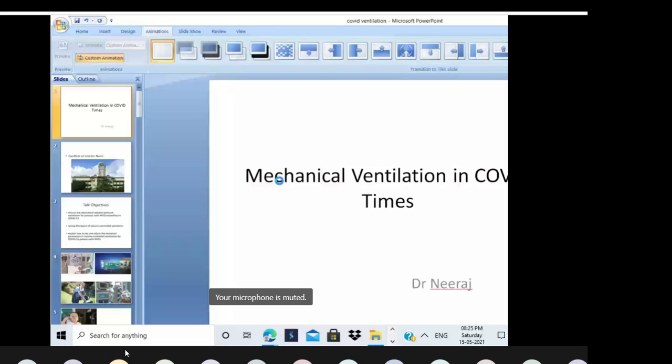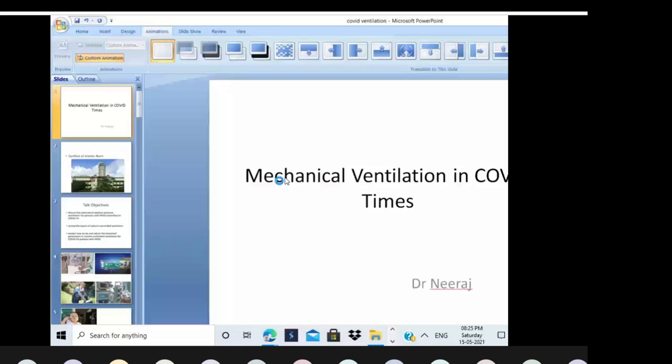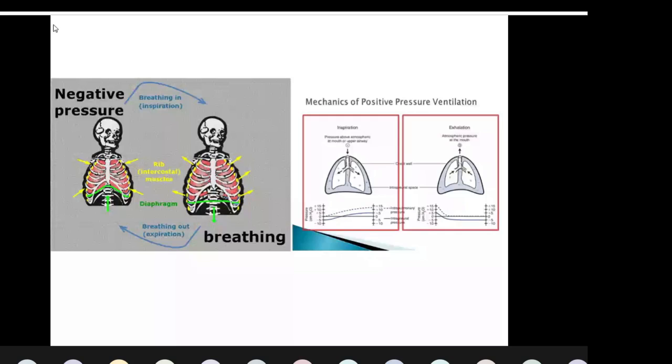It's the normal physiology. This is in a normal respiration. This is what happens as well in a non-invasive ventilation. But when it comes to invasive, this is taken topsy-turvy. What happens in invasive ventilation is that your machine creates a positive pressure and blows that into your nose or airway and into your lung. And you are made to relax your diaphragm, and accept whatever is given.